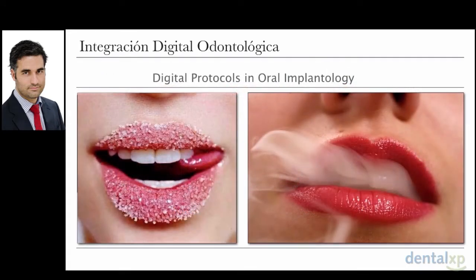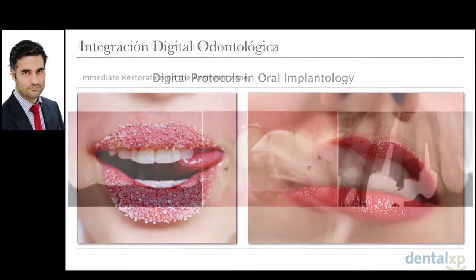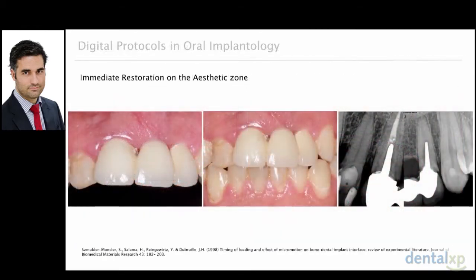Okay, let's talk about some digital protocols. I would like to introduce my first patient. This is a patient that came to my office. He was not feeling very happy with this fixed prosthesis. It was being debonded every week, and the patient was very uncomfortable, and the aesthetics were not okay. So he wanted a definitive solution.